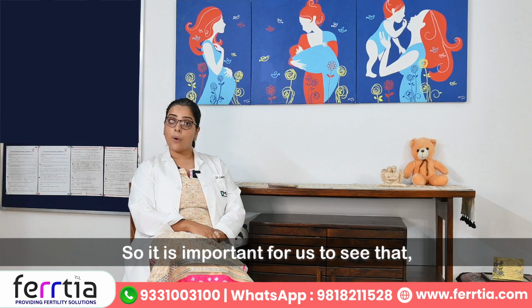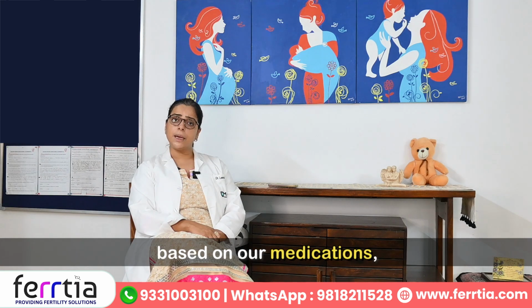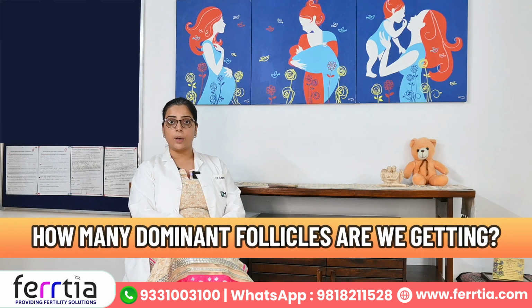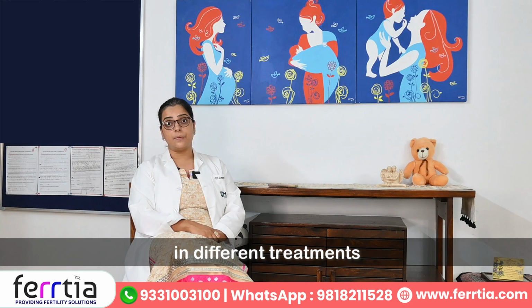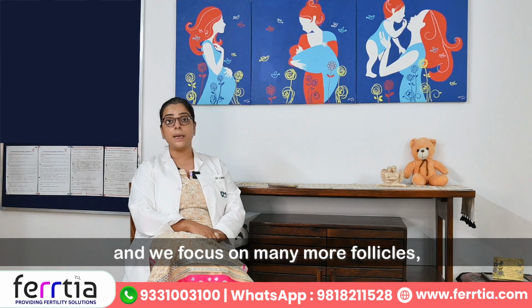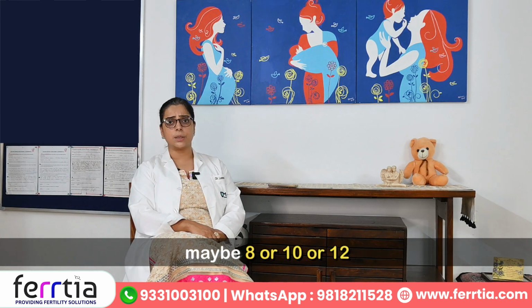So it is important for us to see that based on our medications, how many dominant follicles are we getting? The number of dominant follicles are different in different treatments. We focus on 1 or 2 follicles in IUIs, and we focus on many more follicles, maybe 8 or 10 or 12 when we do IVF cycles.